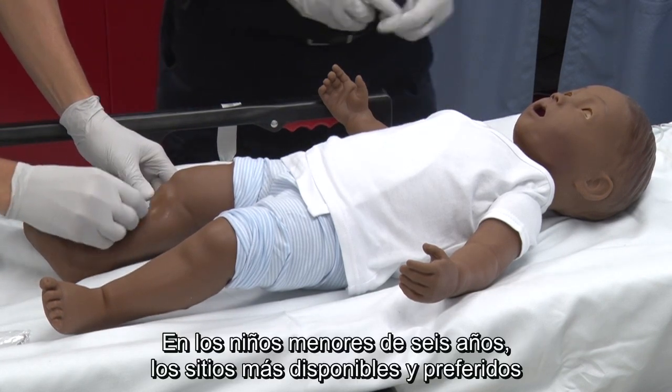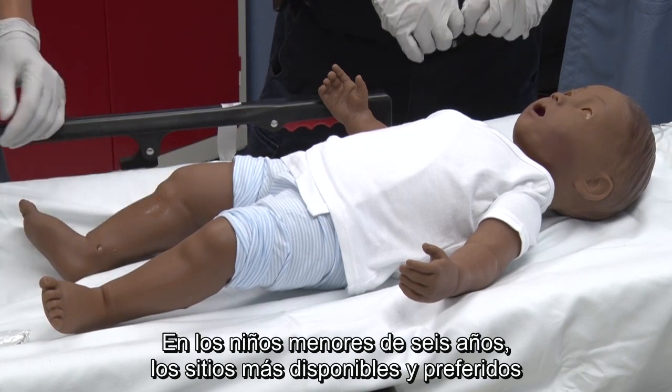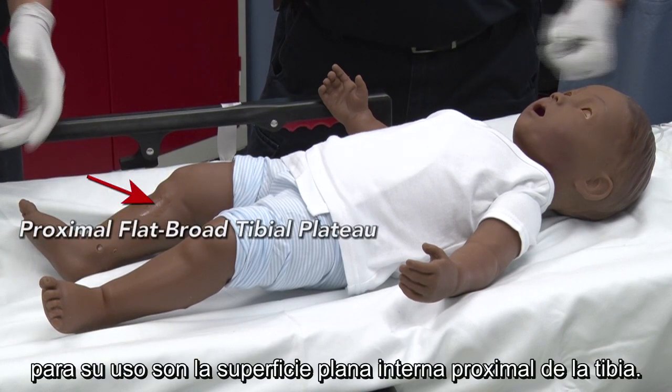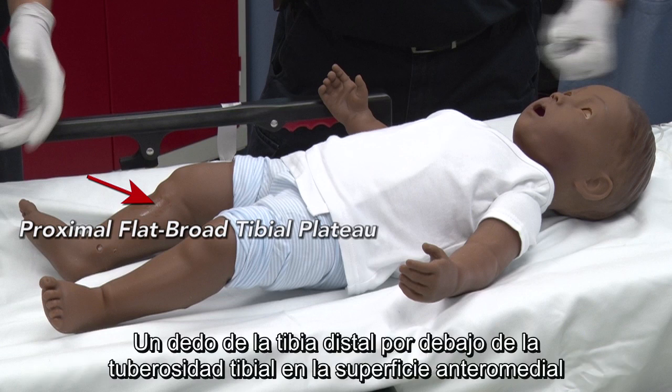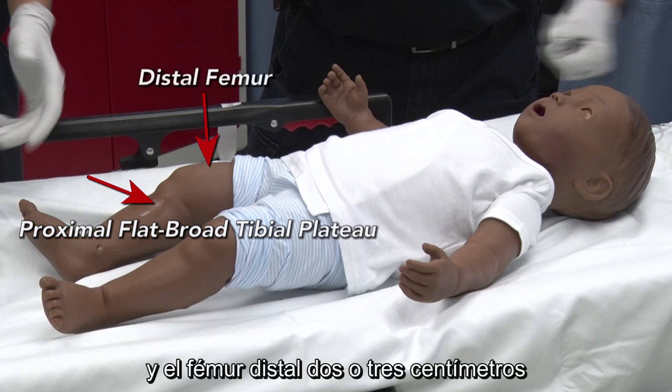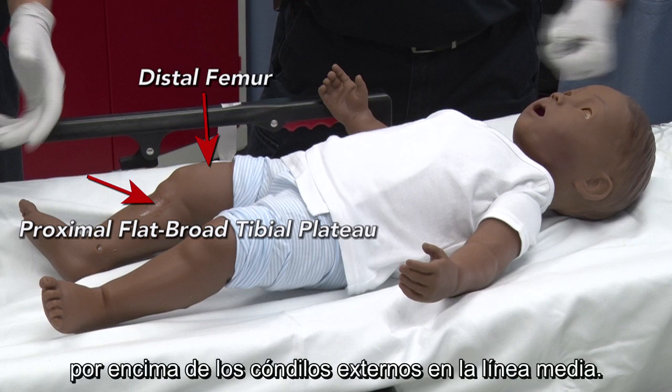In children younger than 6 years, the sites most readily available and preferred for use are the proximal flat broad tibial plateau, 1 to 2 finger breadths below the tibial tubercle on the anteromedial surface, and the distal femur, 2 to 3 centimeters above the external condyles in the midline.